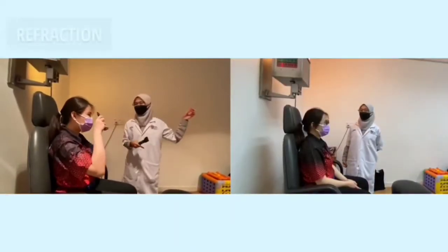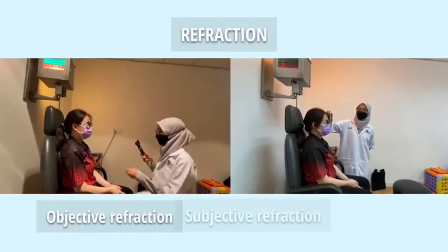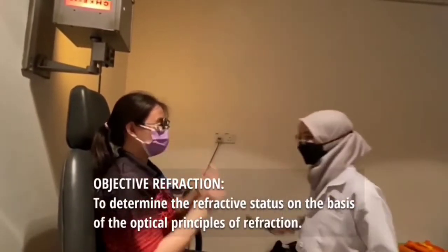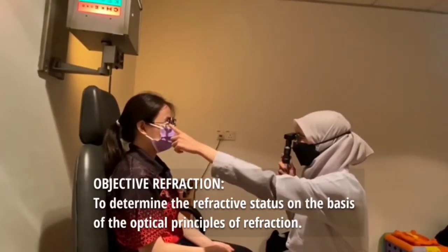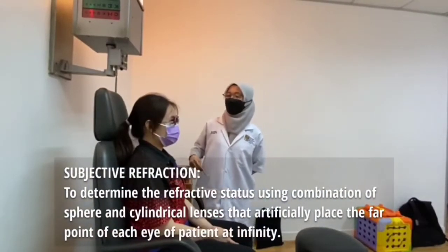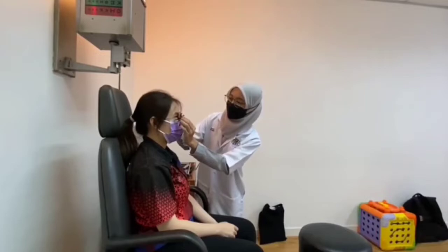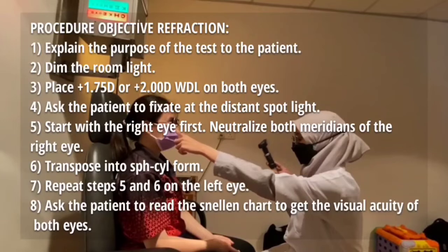Next, the examiner will do refraction. There are two types of refraction: objective refraction and subjective refraction. Objective refraction is to determine the refractive status of the patient objectively by using instruments such as retinoscopes or autorefractors. On the other hand, subjective refraction is to determine the refractive status of the patient subjectively. It provides best VA with accommodation relaxed. These are the steps to carry out objective and subjective refraction.